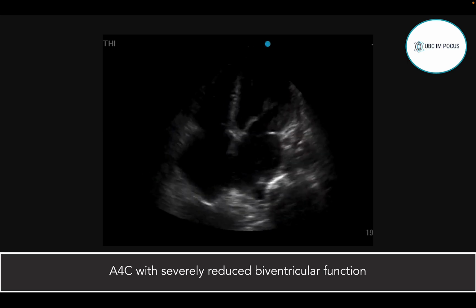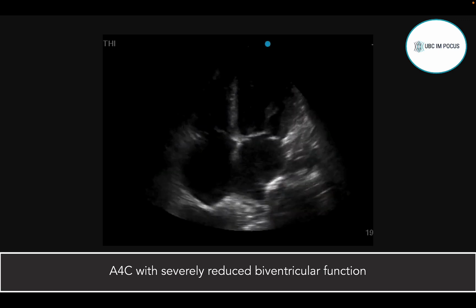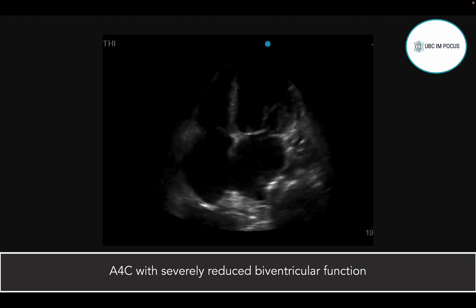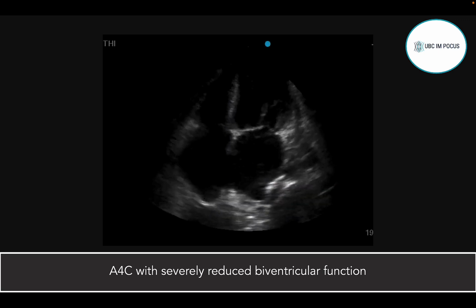I also am visually just looking at that mitral valve for LV systolic function and saying, it doesn't look like it's opening that well. You can't measure an EPSS from this view, but sometimes just that lack of valve opening can give you a clue as well. So I would put this one in the severely reduced camp, so an EF less than 30%.